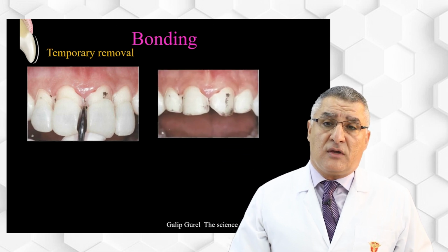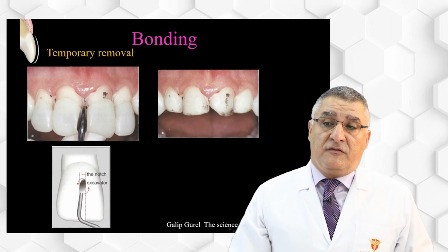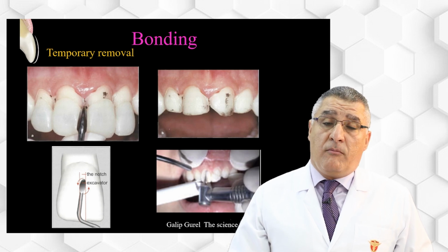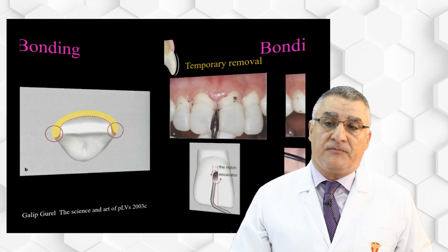Here in the slide we can see the area. Black areas mean that there is a micro leakage related to that. We are not doing bonding for all of the facial surface, we do it only for the spot etching in the middle. So we have to remove the temporary first. You have to check that you remove all parts of the temporary before you start bonding, because any piece of temporary may interfere with the seating of the final ceramic veneers.